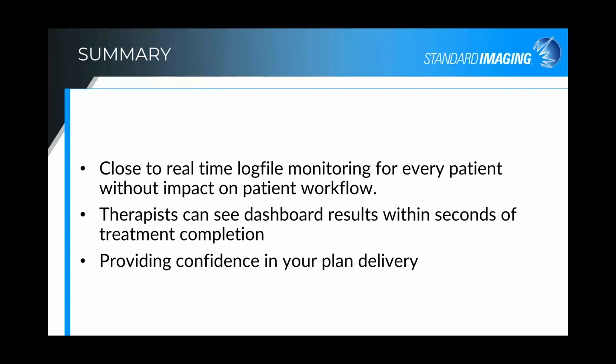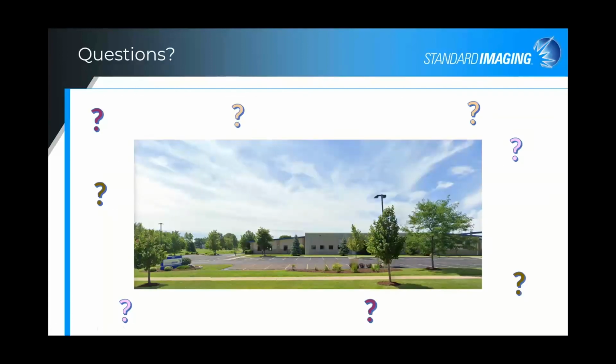So with that, I'm running close to my 30-minute limit, and in summary, I'll just go ahead and close. Close to real-time log file monitoring for every patient can be performed with Linac View without impact on patient workflow. Therapists can see dashboard results within seconds of treatment completion, and Linac View can provide confidence in your plan delivery. So then, thank you for your time and attention.